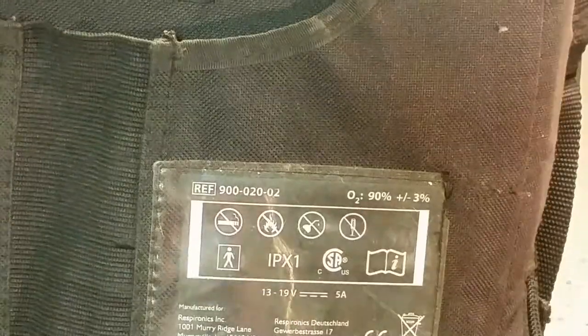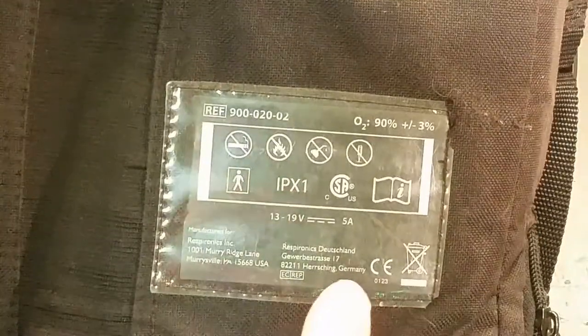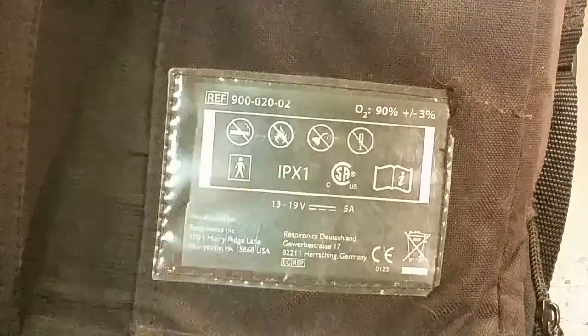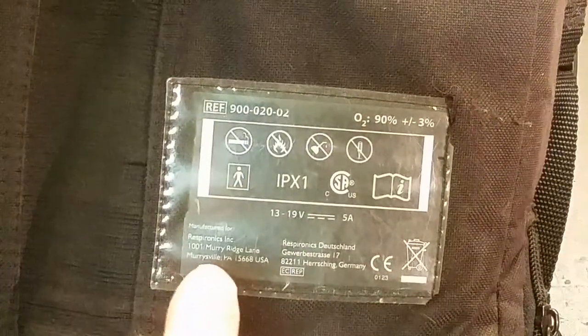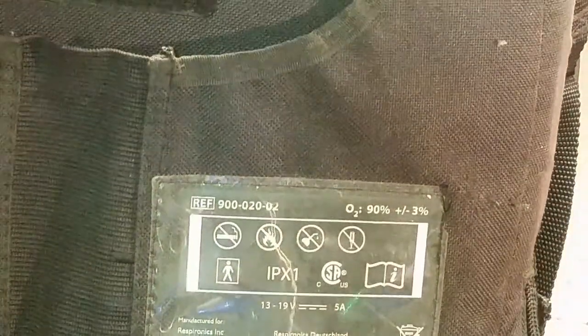Oxygen output 90% - that's quite a lot. Let's see if we can do a flame test. This is approved medical equipment. Made in Germany maybe - some designed in Mersville, USA. CE marking and don't throw it in the garbage.